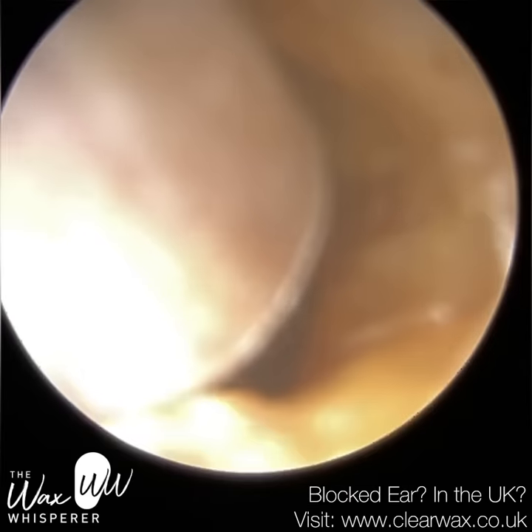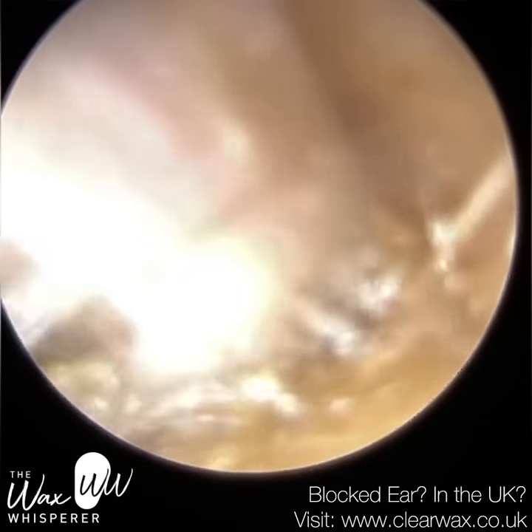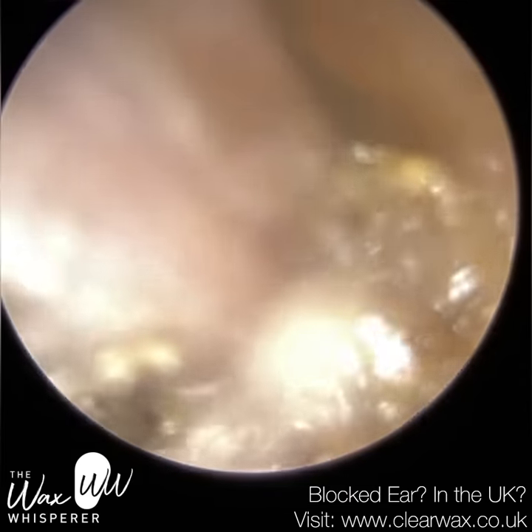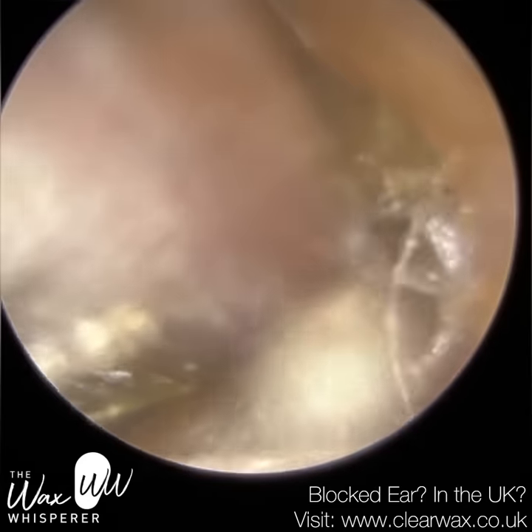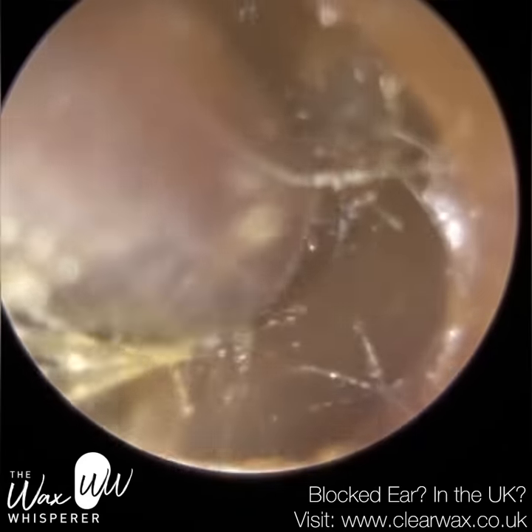We have here a patient who attended with a blocked right ear. As you can see, I'm just performing microsuction — we're using a gentle vacuum to suction this wax out of the ear.